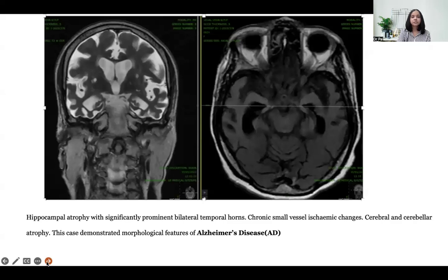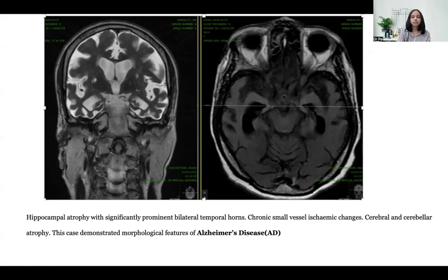Illustrative case 2: a 61-year-old female presenting with anterograde episodic memory loss for two years associated with apathy. Scans demonstrated severe hippocampal atrophy with significant bilateral temporal horn prominence, small vessel ischemic changes, and cerebral and cerebellar atrophy. This case demonstrated morphological features of Alzheimer's disease.